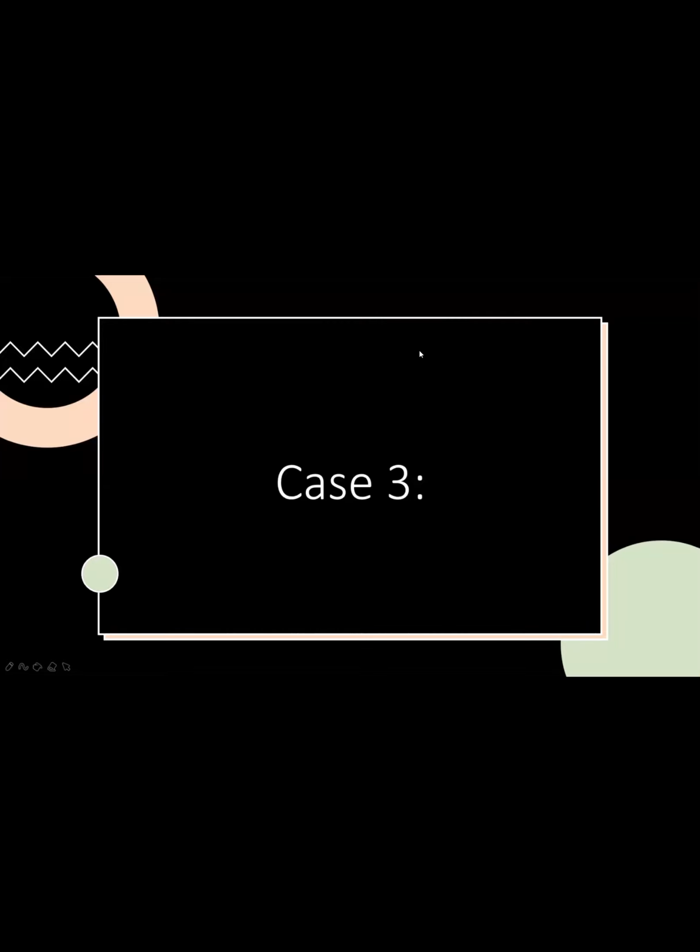There's no CBCT, Sally? No, I'm sorry. Well, we do have a CBCT, and I'm so sorry that I did not share it with you guys. The CBCT showed that it had invaded the floor of the nose, and the patient was referred to Mount Sinai Hospital, and he's pending the surgery.